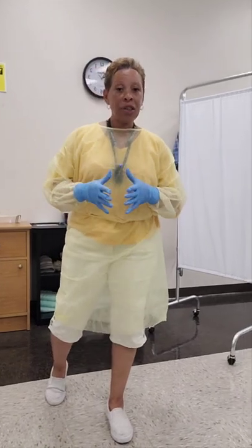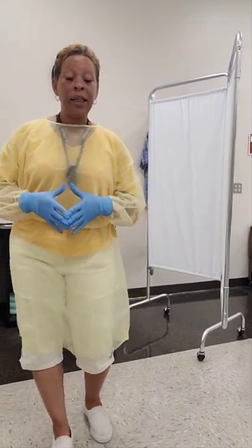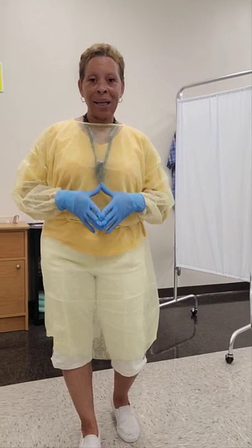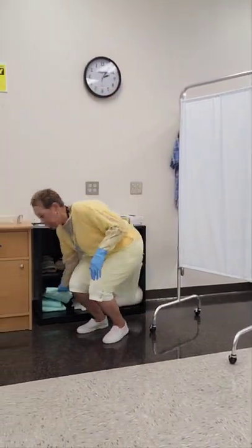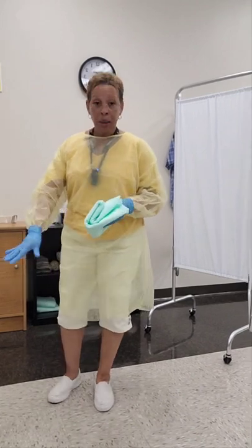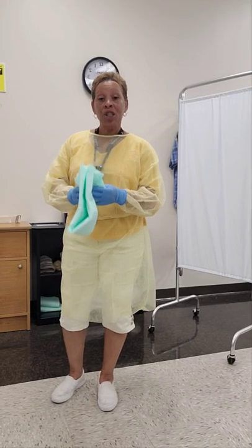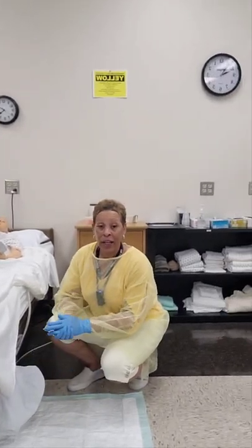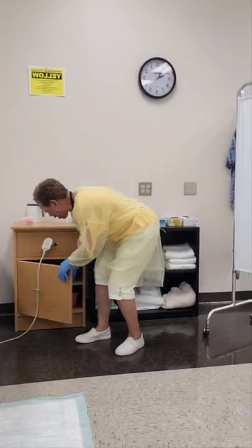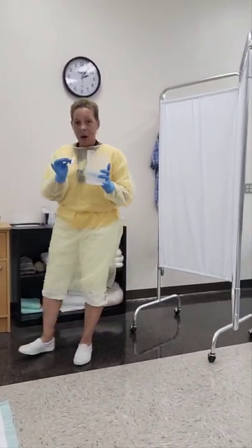With Headmaster, your supplies will not be located at the bedside. Instead, your supplies will be located on a centralized table that is easily accessible to you in the testing room. The first supply item I'm going to collect is a chucks. I'm going to use this chucks as a clean barrier to place on the floor underneath the urinary drainage bag. If the testing site does not have chucks, you can always use a towel. Then I'll collect the remaining supply items: a graduate or measuring container and one alcohol wipe.